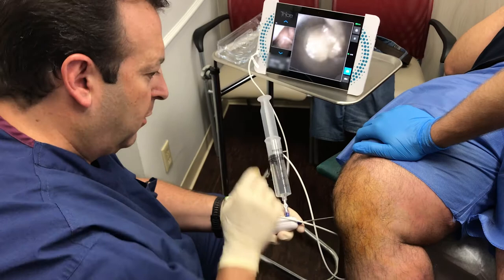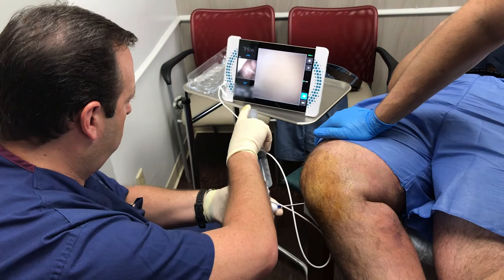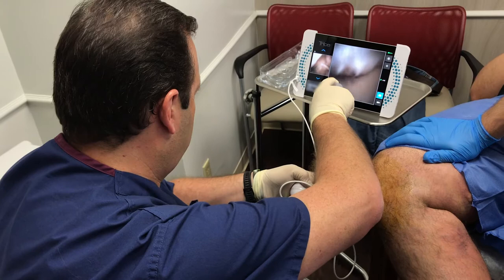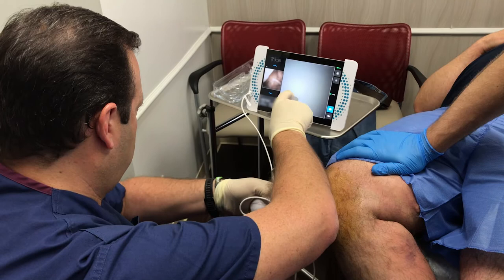Are you able to bring the leg up any higher? Just let him try and cross your leg if you can. Still pretty sensitive there. I just went there and he aspirated a bunch of crap out of things. It was actually worse — about three needles.